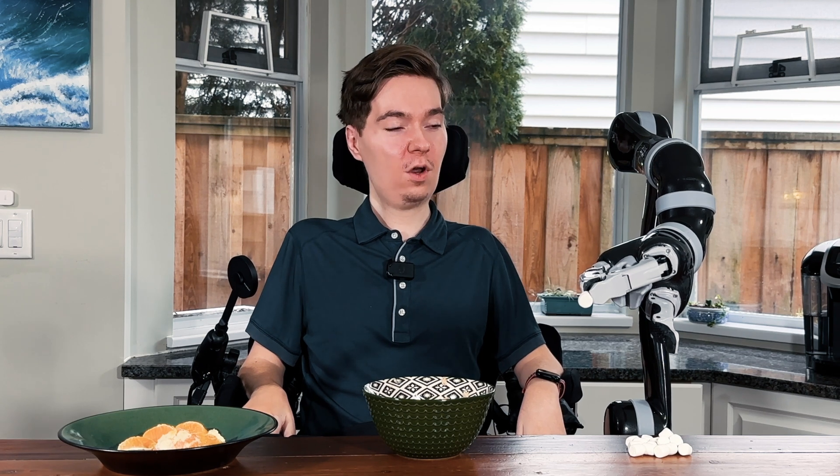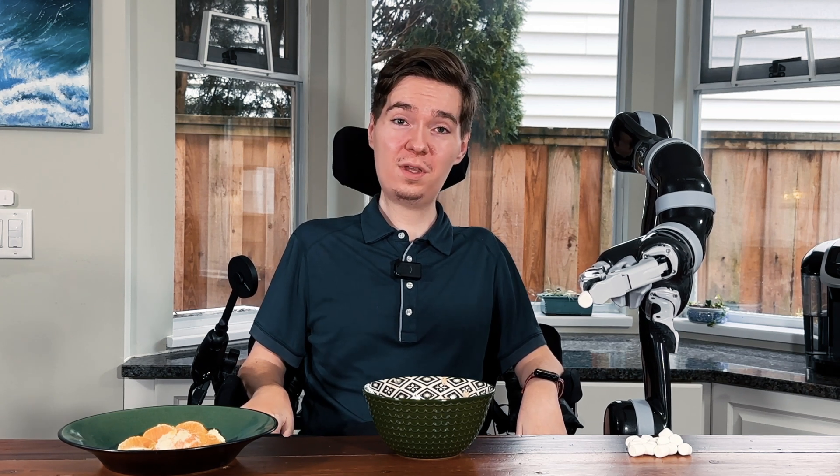Hi, Taylor Danielson here from Canova Robotics, and today I'm going to show you how the Jayco robotic arm can enable you to eat all of your favorite meals completely independently.